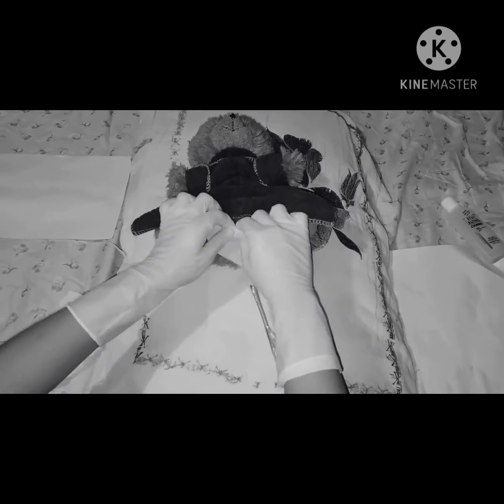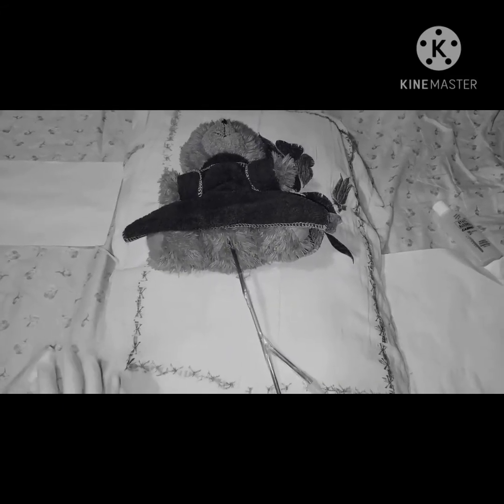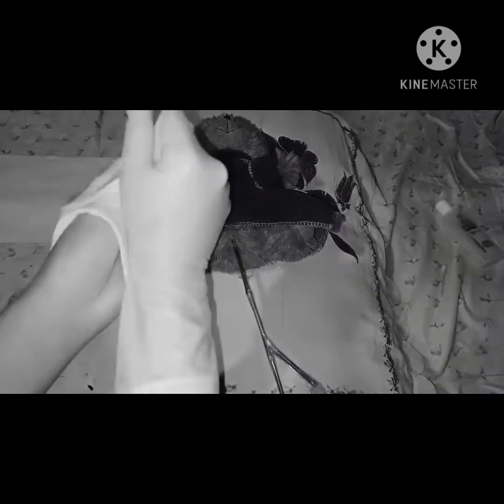I'm going to remove this and this. I'm going to discard everything that I used, and remove my gloves. The last thing that I must do before I leave is to do hand hygiene.